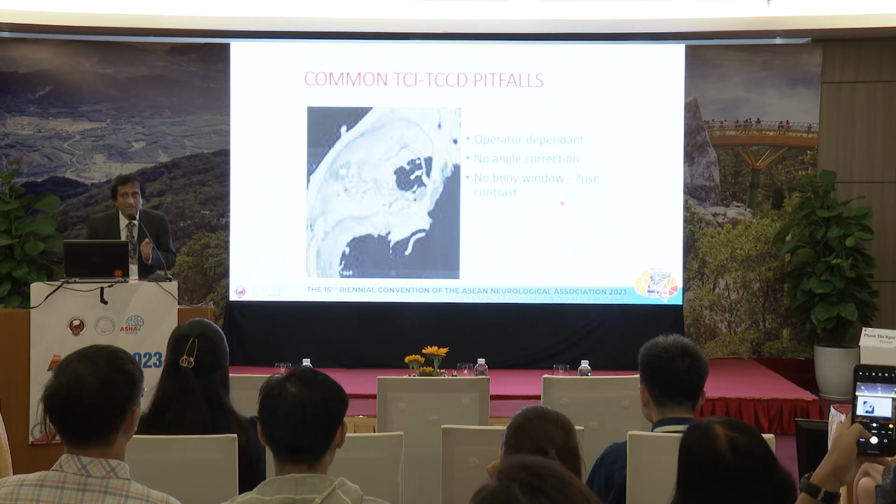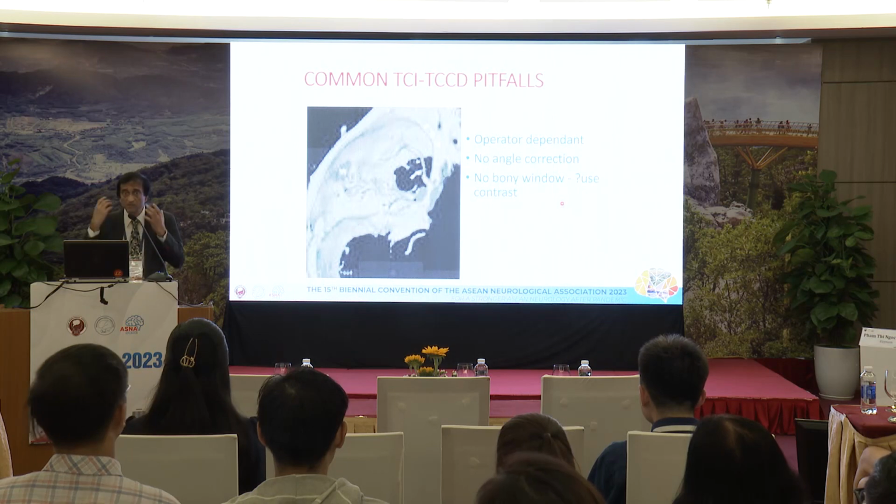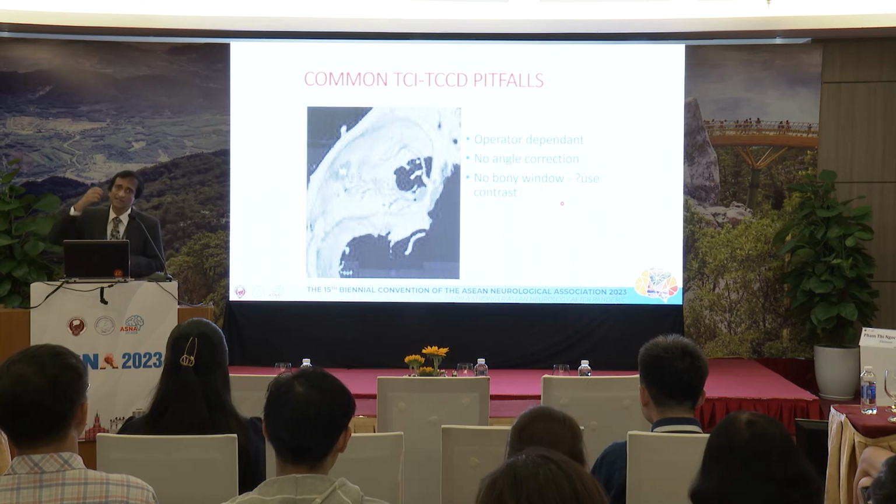First, it depends on how good you are. It's not the machine, it's often us. They're very good machines nowadays. So you must spend some time, learn the technique, and make sure you know where you are. Find the landmarks, find the midbrain, find the vessel, and then do the correction.